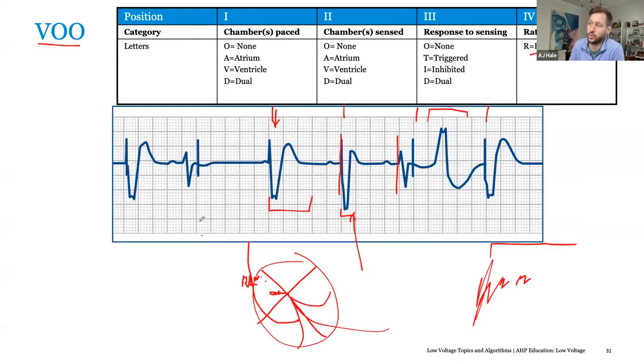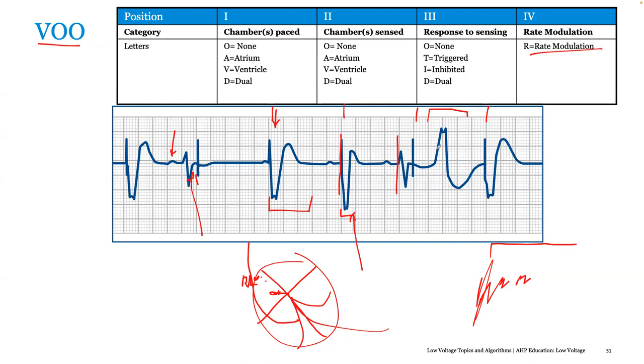Anytime you're pacing into a T-wave, you run the risk of being proarrhythmic. So you could pace them into VT or VF. So in those cases, that is why we would increase the heart rate. The idea being that we would beat out any kind of intrinsic activity, and we would beat out any kind of PVCs, because you're controlling the refractory period of the tissue. And by doing that, you limit the instance of that occurring. Does that make sense? Yes, it does. Thank you. Yeah, perfect. No, that was a great question.